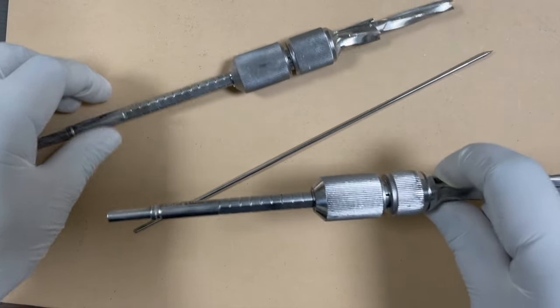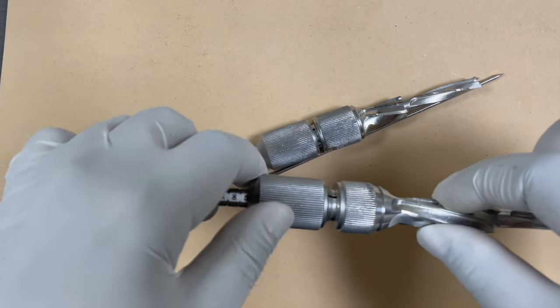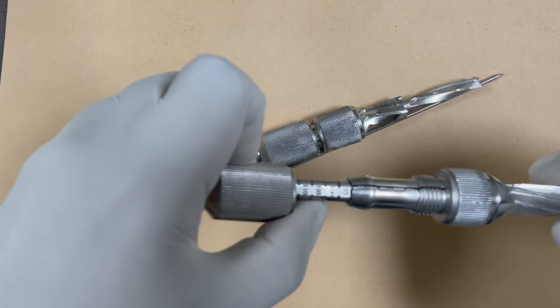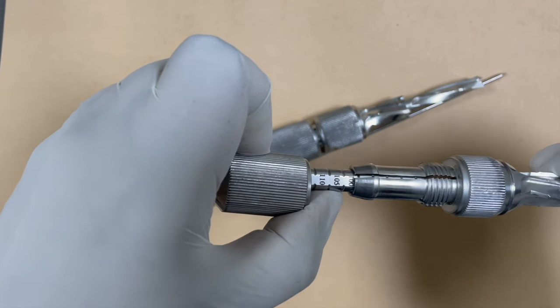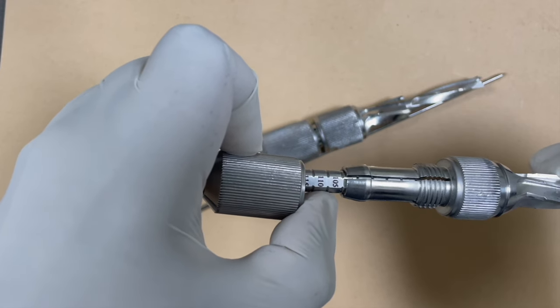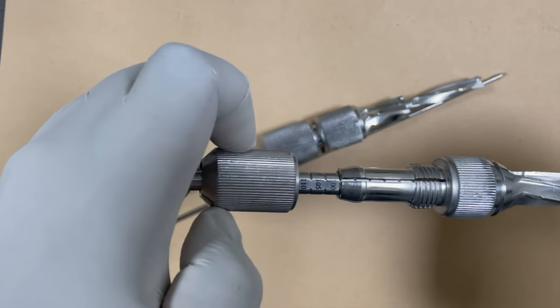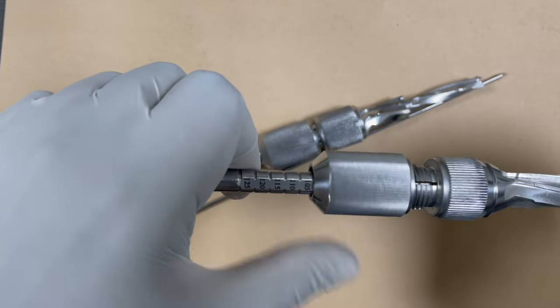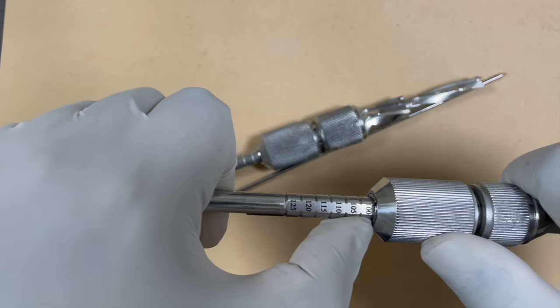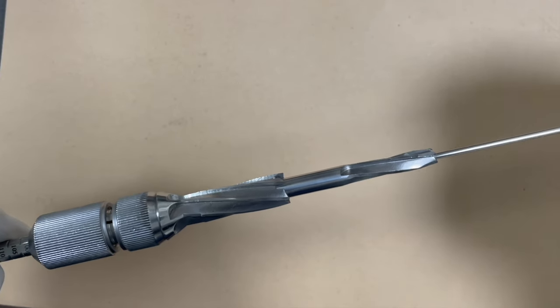Now if you look at the triple reamer, it has a knob meant for loosening the outer reamer. Once it is loosened, you can see the markings — 95, then 100, then 105. We have to set the triple reamer to 100 so that this part is visible. Once set, tighten the knob fully; it will automatically end up locked at 100. After locking at the 100 marking, pass the reamer over the guide wire you have already inserted and ream the track.